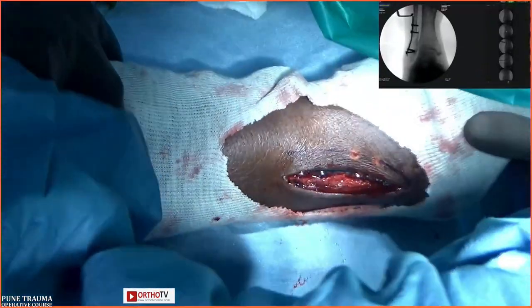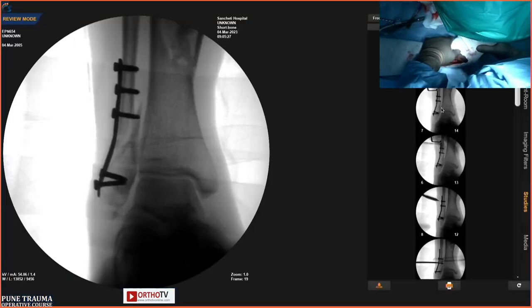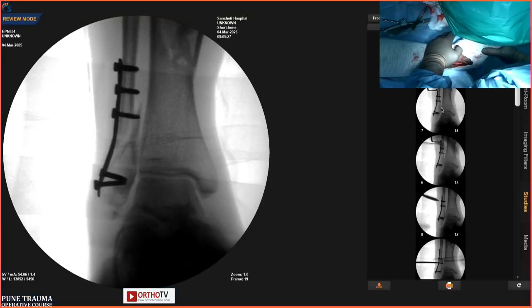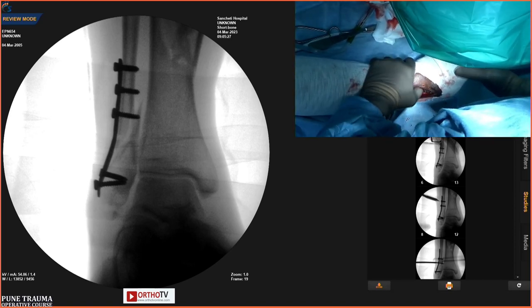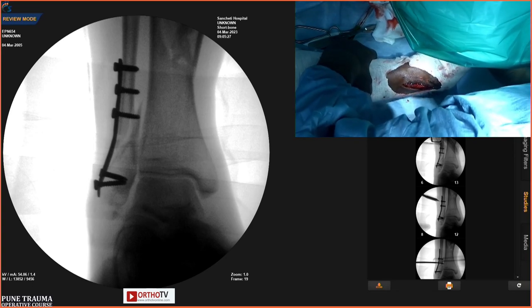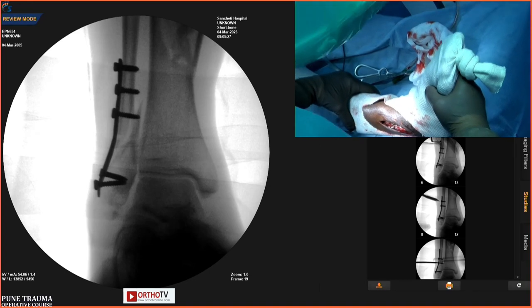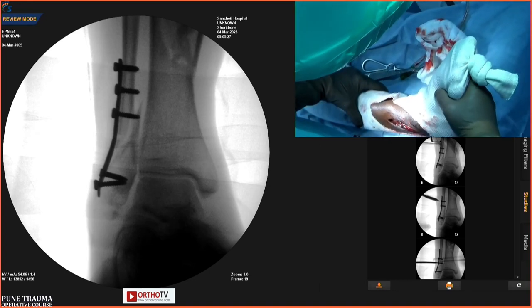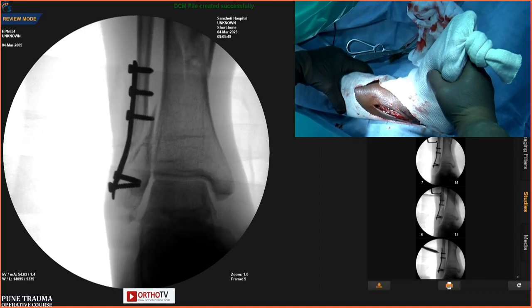See this. Like was pointed out, there is a spiral element there. Would you prefer a longer plate and remove that third screw from the top? Yeah, that's just a spiral chip. Okay, it's a flake. If you see this.